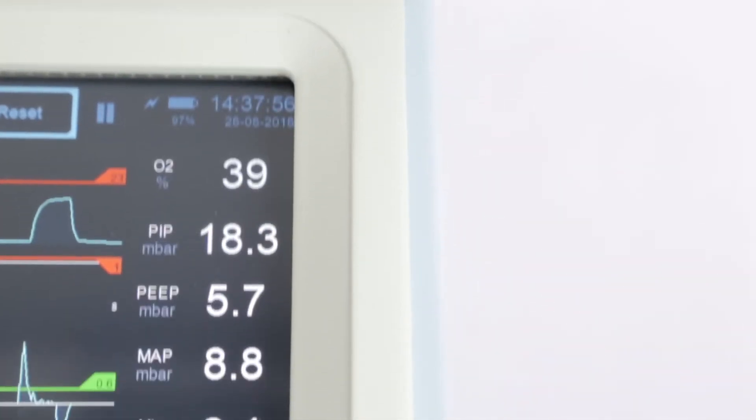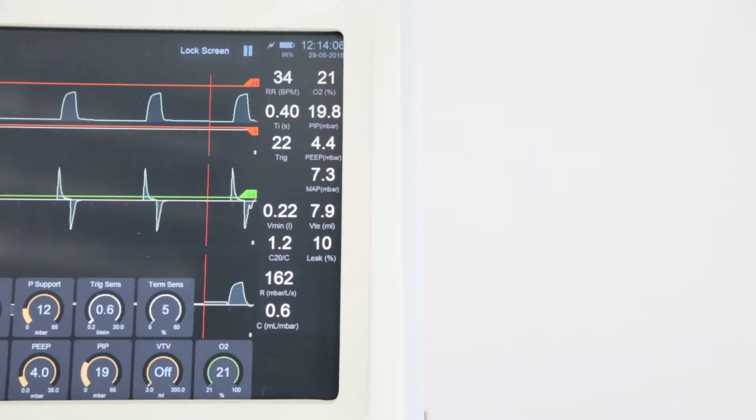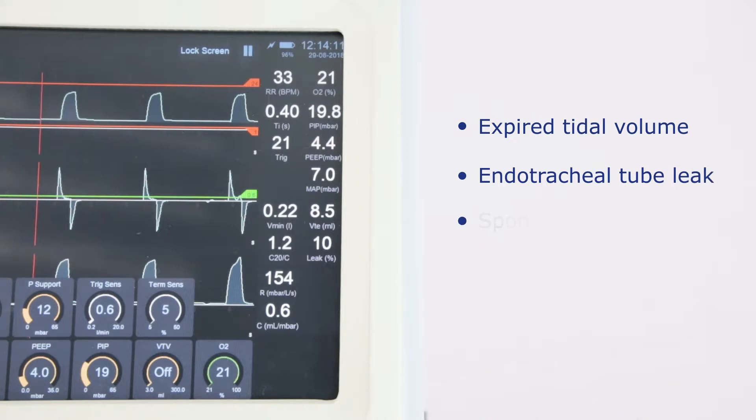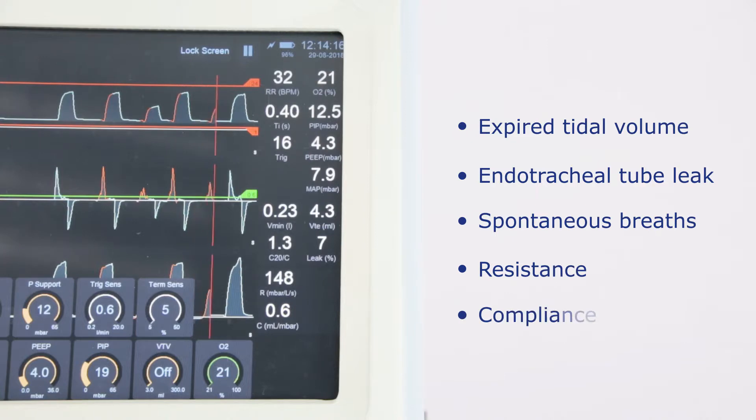Then look in the monitoring column and observe the measured pressures, the expired tidal volume value, any endotracheal tube leak, if there are any spontaneous breaths more than the set breaths, and any changes in resistance and compliance.